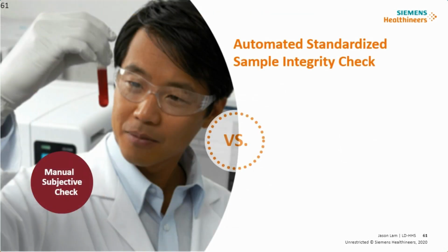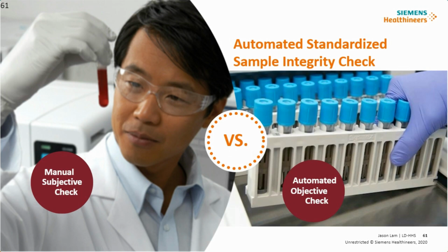Because when you look at these checks, you're really comparing that manual method versus that automated method. The manual method is really subjective, right? Whereas I could say one thing and my colleague could say another thing. So trying to minimize that is extremely important.